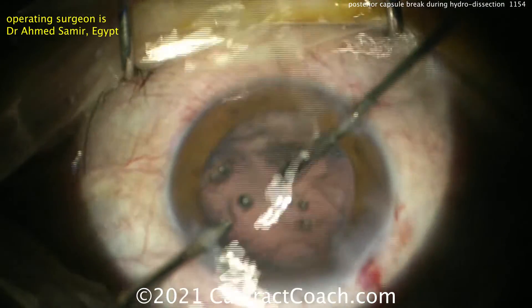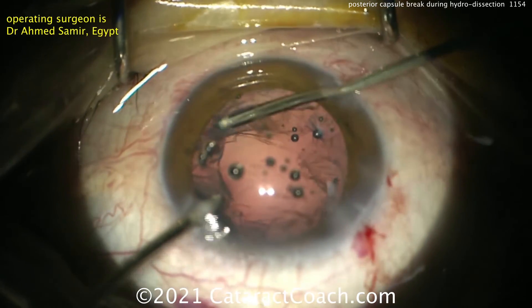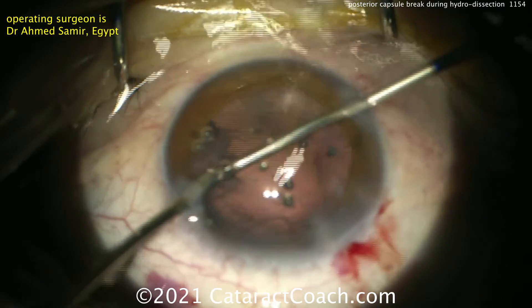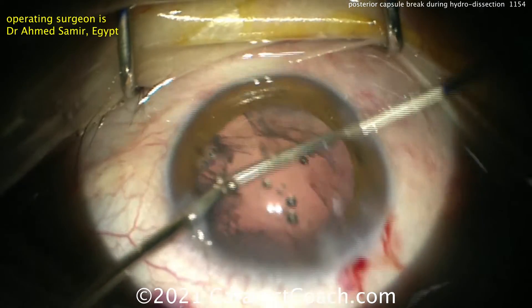In these types of cases, want to look very carefully at the posterior segment. Make sure there are no retained lens pieces. You can put on an indirect ophthalmoscope in the operating room and look yourself, check the next day, or send your patient to a vitreoretinal colleague and they can check for you.